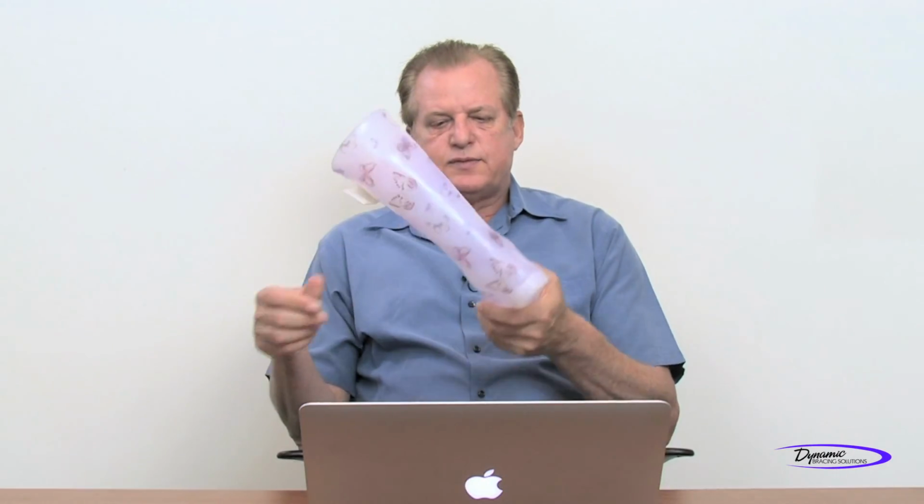So there is a lot of things. The big trend now is putting butterflies or cute stuff on plastic. Yes, to a certain degree, this is cosmetic, but it really doesn't necessarily meet the need of the individual to be more functional, be able to walk with less energy and so forth. So there are different areas or types of things that we want to consider as far as cosmesis.